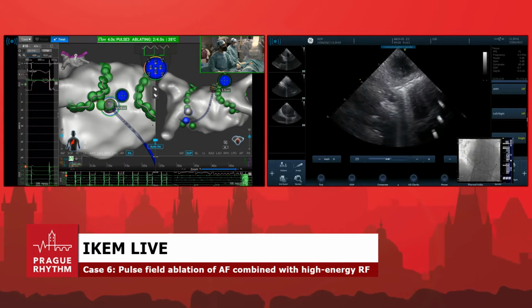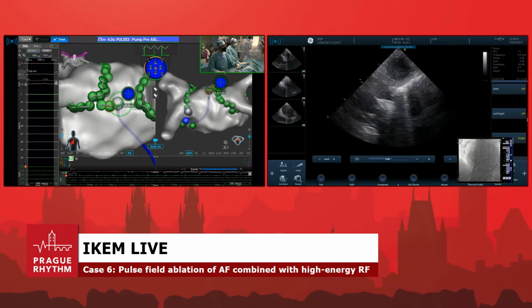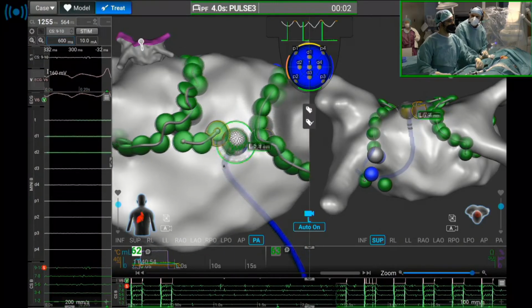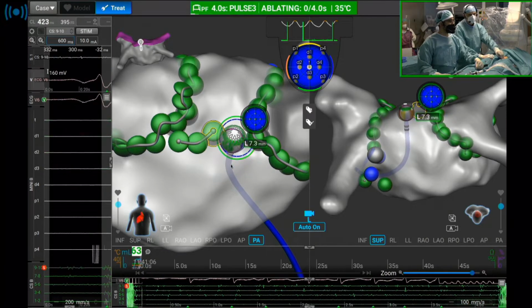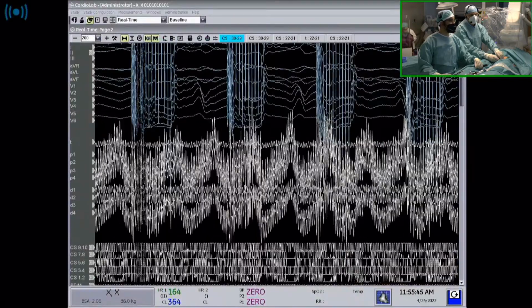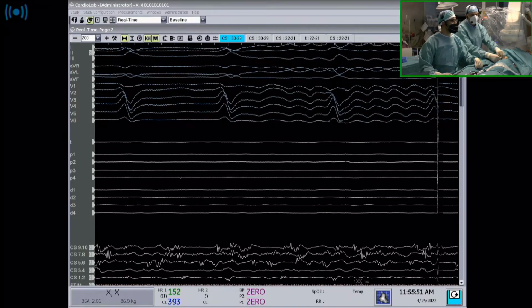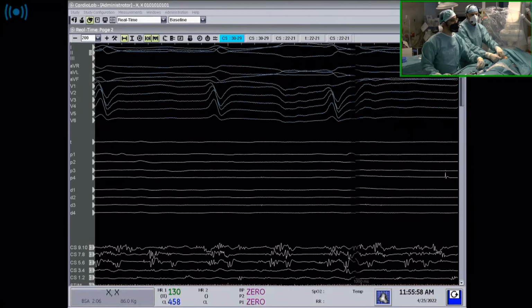Here you see signals and try to induce. After application they should be diminishing. Oh, sorry, this is probably the coronary sinus. But here we see there is no signal already. Can we have now a running screen with signals? After application it's basically empty, even before application. I think that was already repeated. Let's look a little higher on the roof.